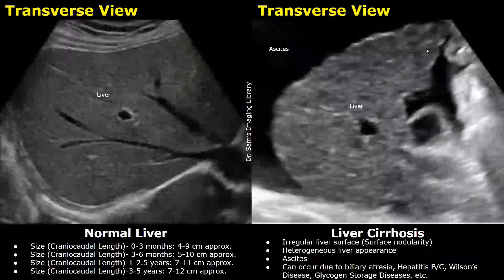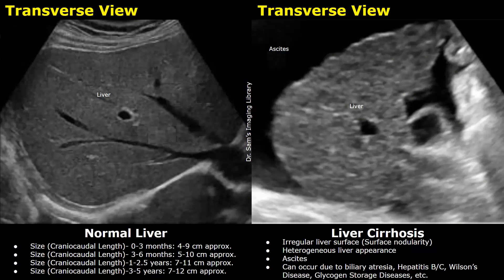In children, liver cirrhosis can occur due to biliary atresia, hepatitis B or C, Wilson's disease — in which there is copper buildup in the liver — glycogen storage diseases, and various other causes. On ultrasound, irregular liver surface or surface nodularity will be seen, the liver will have a heterogeneous appearance, and cirrhosis can also cause ascites with anechoic fluid surrounding the liver.